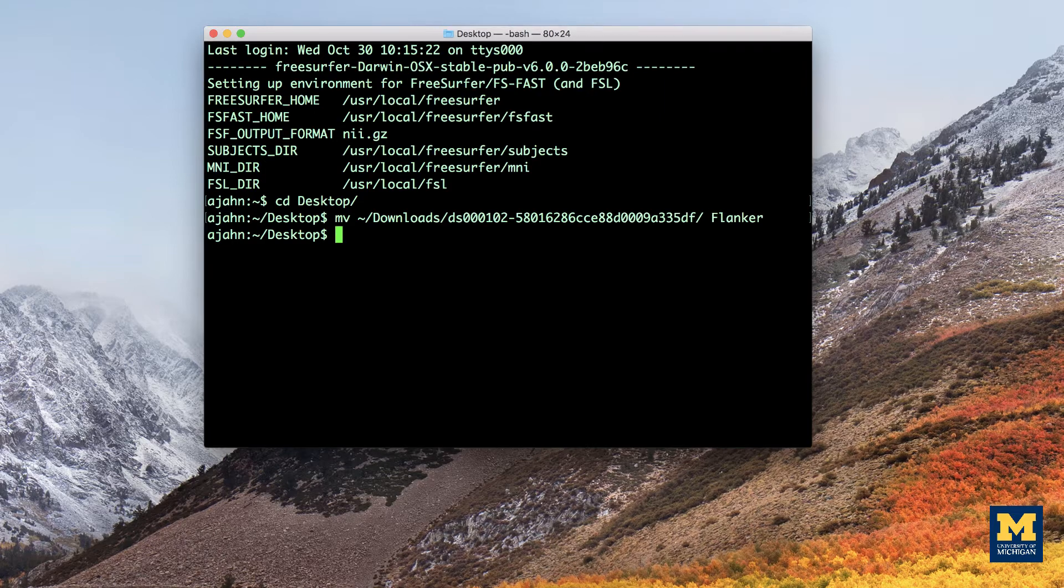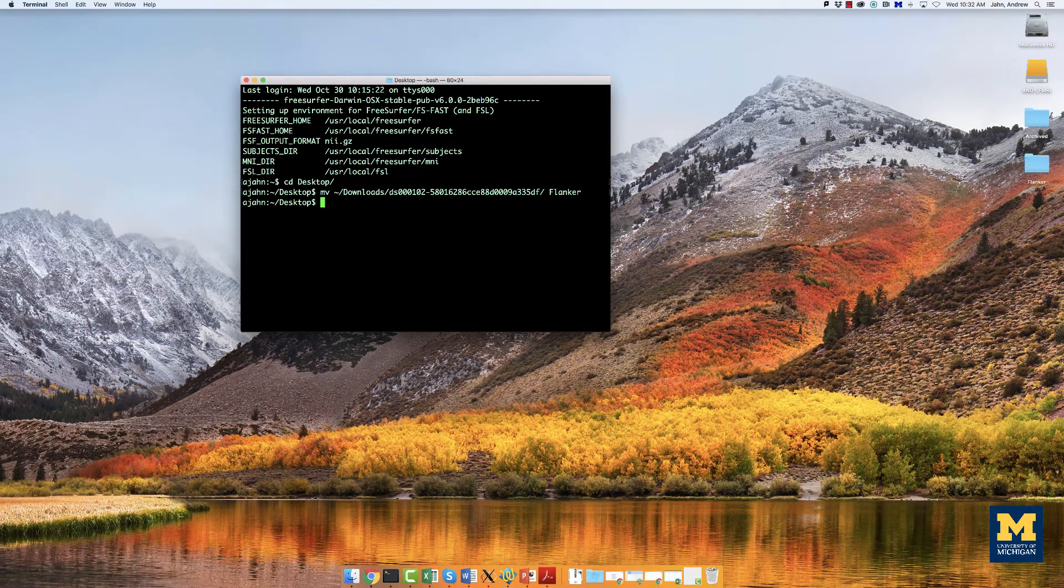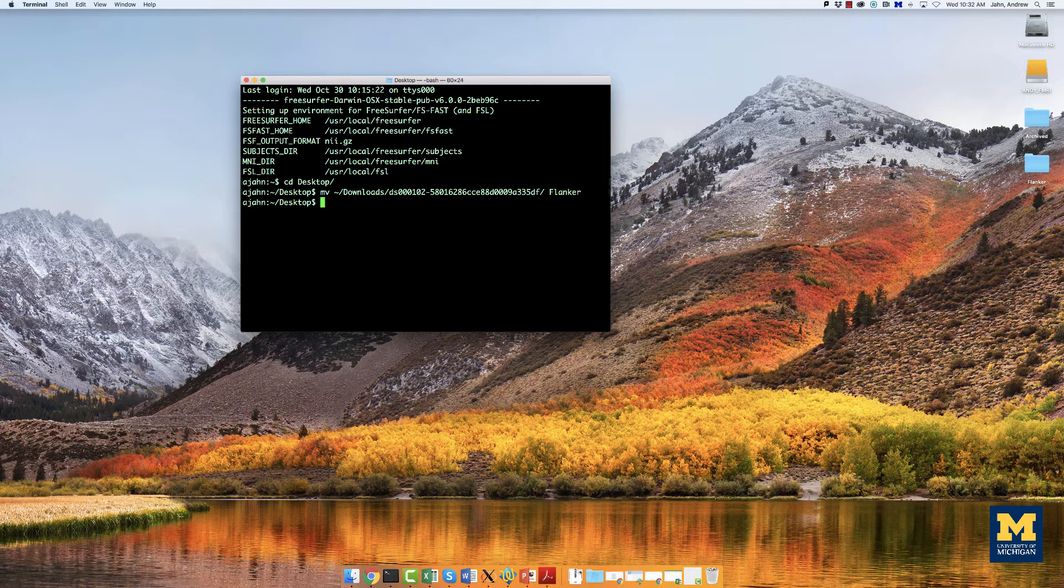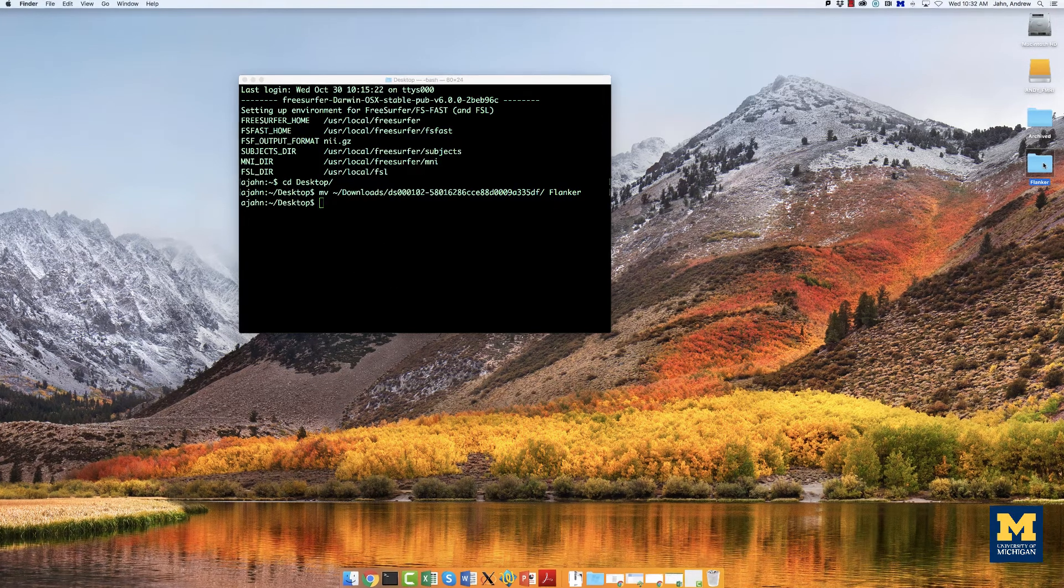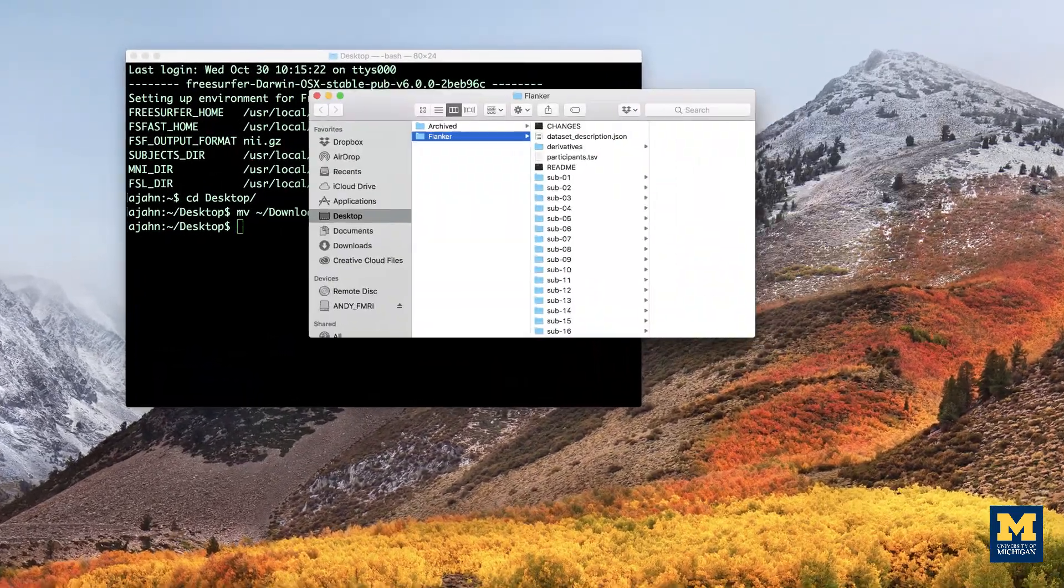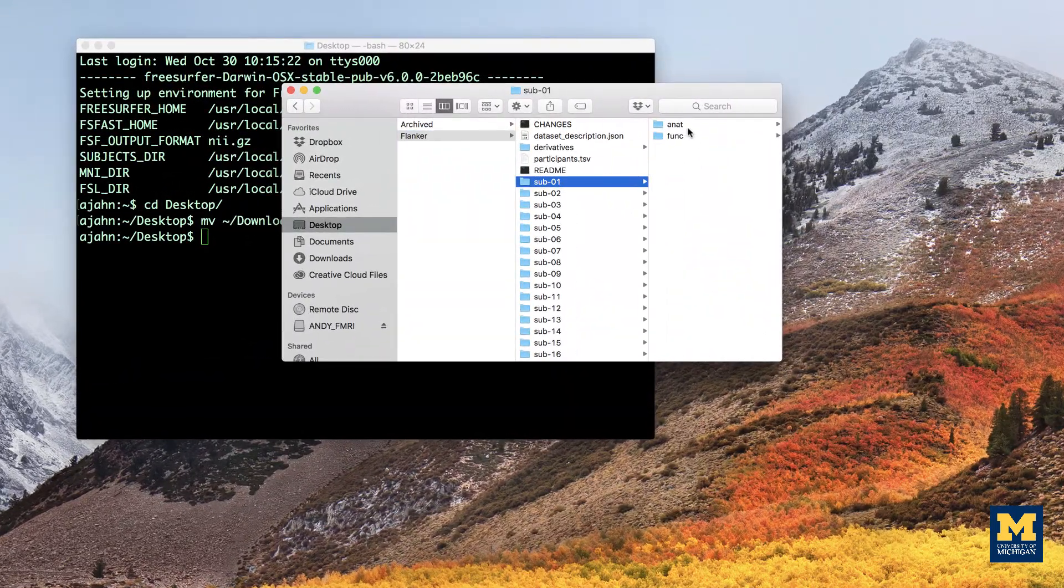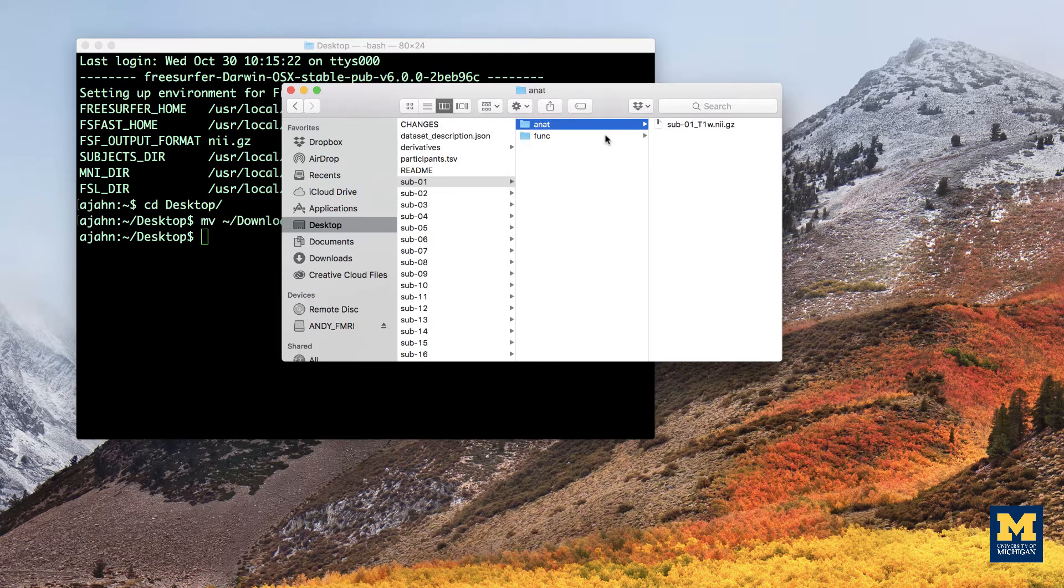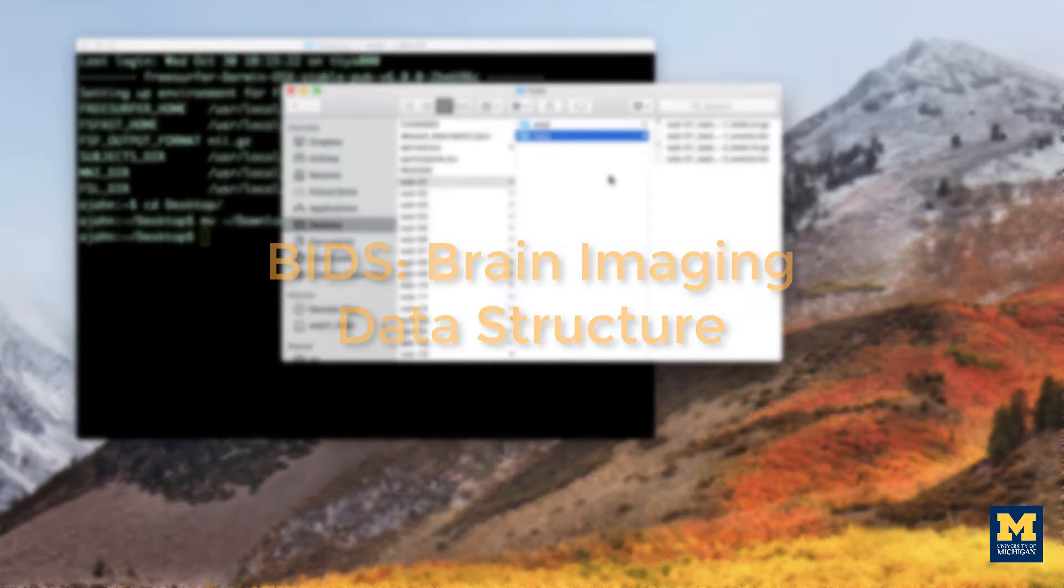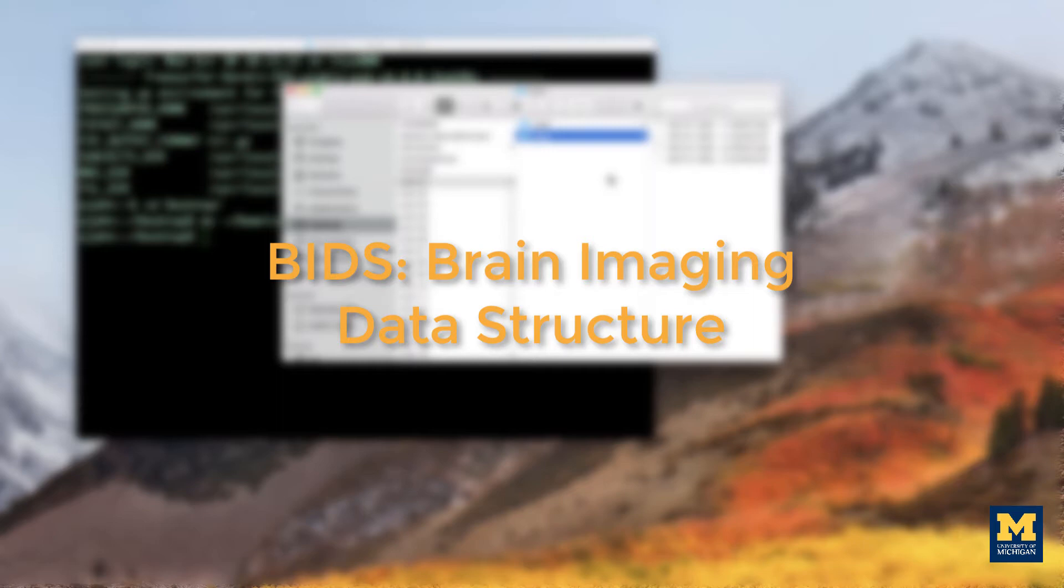As you saw in the previous tutorial, the data set has a standardized structure. Each subject folder contains an anatomical directory and a functional directory labeled anat and func respectively, and these in turn contain the anatomical and functional images collected during the experiment. This format is known as BIDS or Brain Imaging Data Structure, which makes it easy to organize and analyze your data.